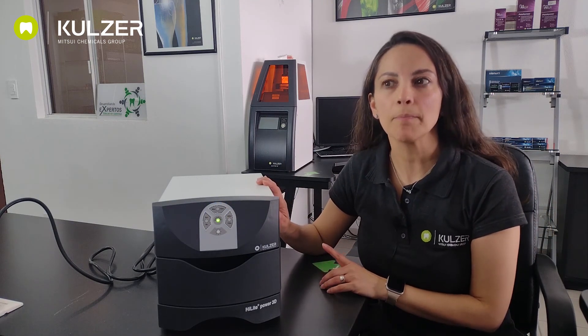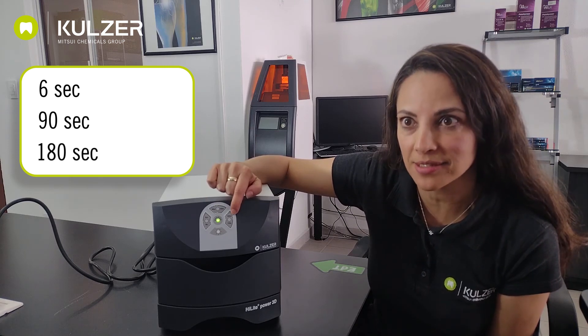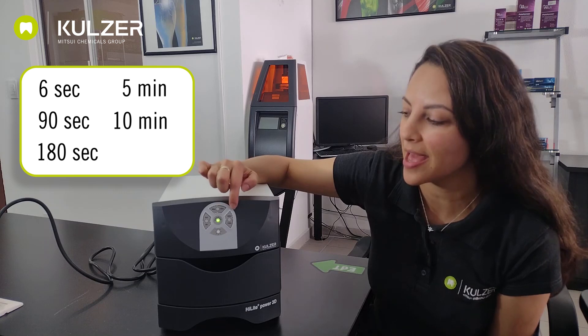If we press the button for more than two seconds, the cycle of 10 minutes is activated. This is indicated acoustically by a signal tone. In addition, there is also a visual indicator. A blue flashing light means the shorter polymerization time indicated on each of the three keypads has been selected. A steady blue light means that the longer time has been selected. The device offers a total of six polymerization cycles: six seconds, 90 seconds, 180 seconds, 5 minutes, 10 minutes, and 15 minutes. The last three cycles are designed to cure work pieces made in the Caraprint 3D printing system.